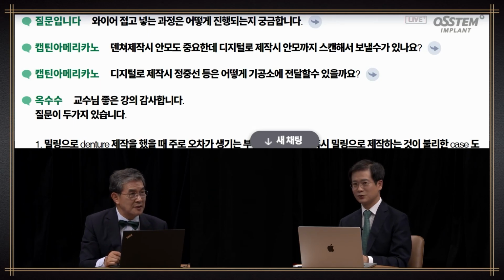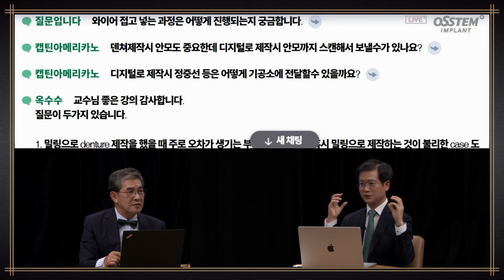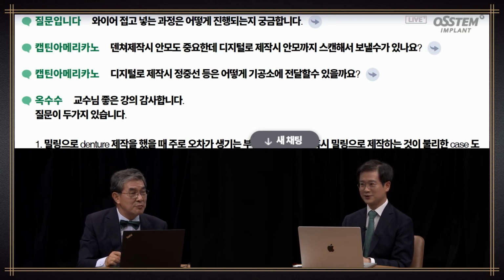Yes. So in the initial start, you use the retro and horizontal information also. Midline and inclinations impact aesthetics, so you also need to send that information. Yes, if you don't have the face scan information, correct.